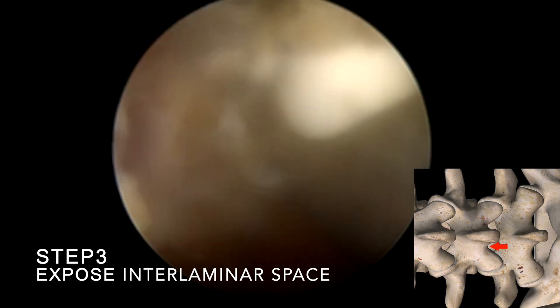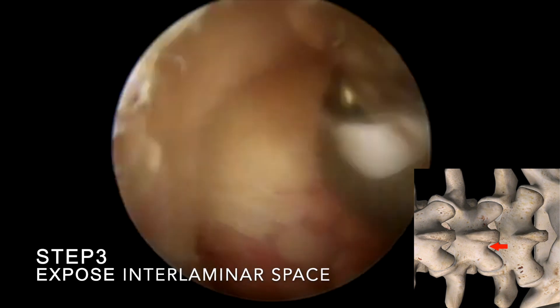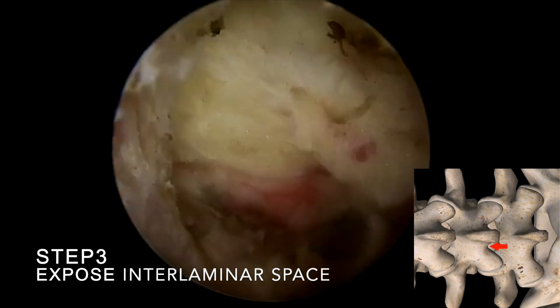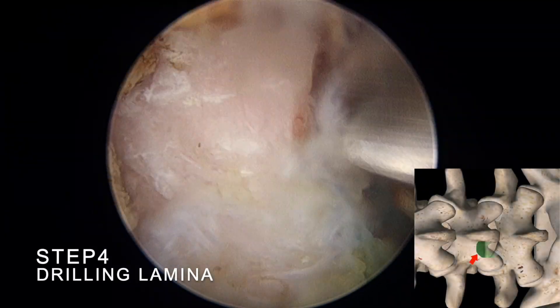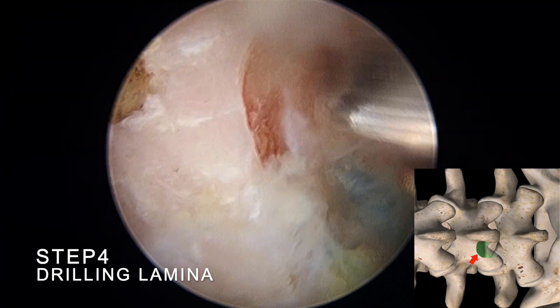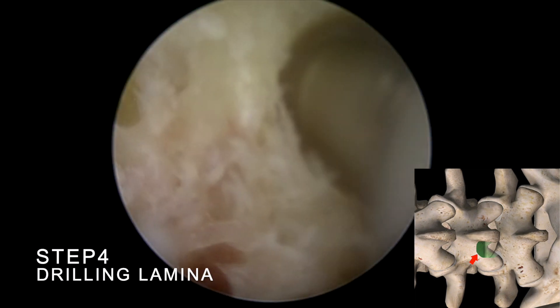Step 3: Move to the spinolaminar junction and expose the interlaminar space. Start drilling from the superficial cortical bone using a high-speed shaver drill, moving from the caudal to the cranial end of the lamina.